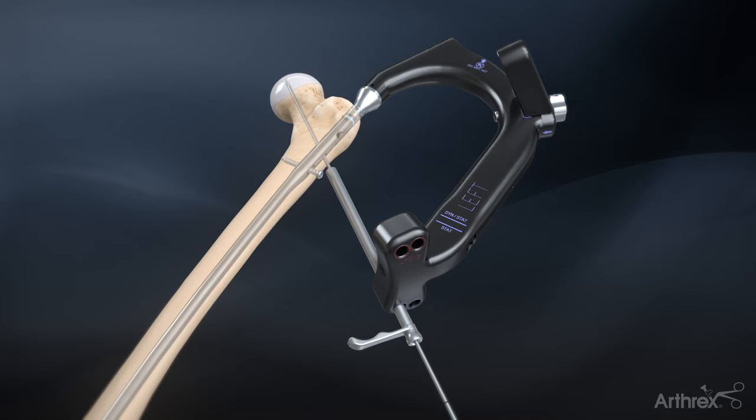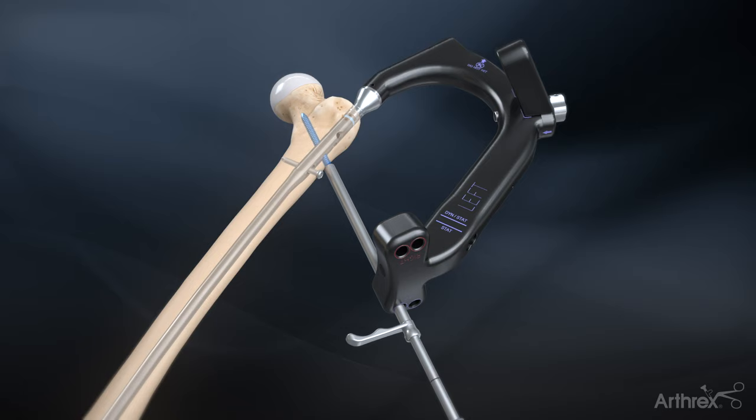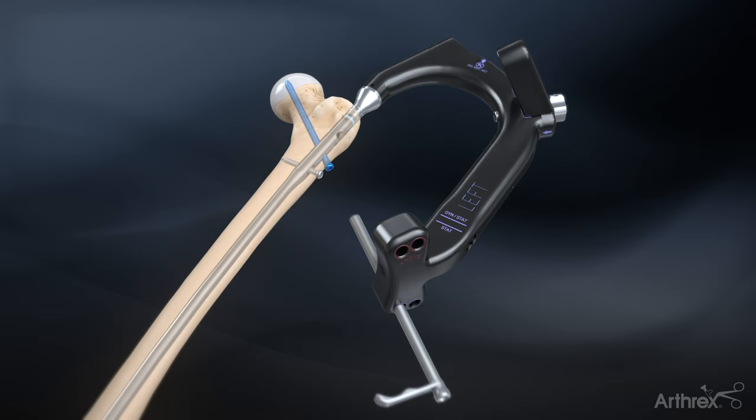Remove the guide pin and insert the 6.5 mm fully threaded cancellous screw assembled on the captured hex driver until the black laser line on the driver is flush with the end of the sheath. Once the screw is fully inserted, remove the screw sheath.